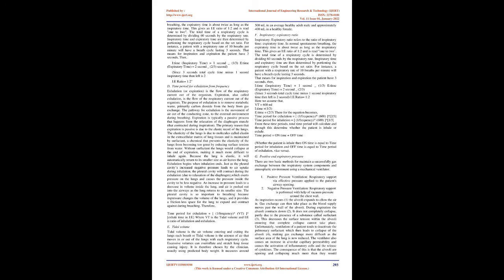Efficient and low-cost non-invasive emergency ventilator. The lungs of the patients who require mechanical ventilation due to COVID-19 are so much inflamed that the oxygen is unable to reach the alveoli when a patient breathes, and the mechanical ventilator acts to force the oxygen flow under pressure to these small air passages. The main aim of the project is to propose a ventilator system with low cost, more efficient and automatic air delivery ventilator with alarm and PEEP.